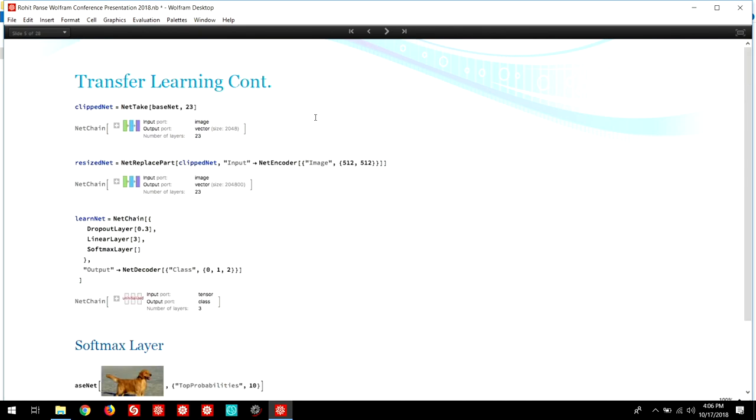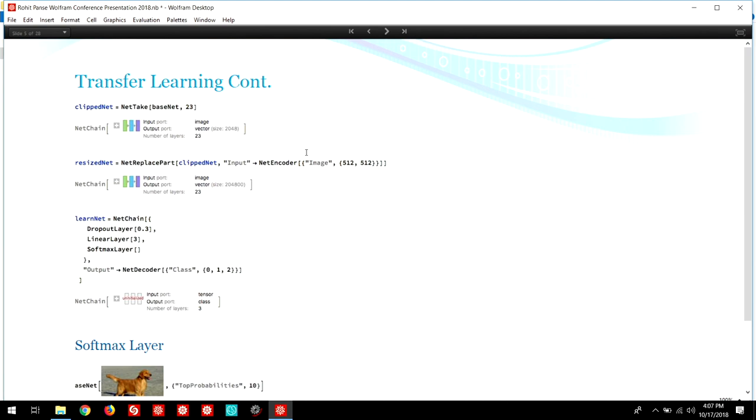Here, I removed the linear and softmax layers. These layers are currently configured to recognize 1,000 classes, and I only need them to recognize three classes of information: normal, bacterial pneumonia, and viral pneumonia. I will add these two layers later on. Below here, I replaced the input layer to receive an input of image dimensions 512 pixels by 512 pixels. I will configure my training images to be this size.